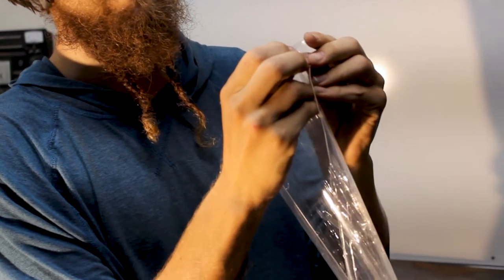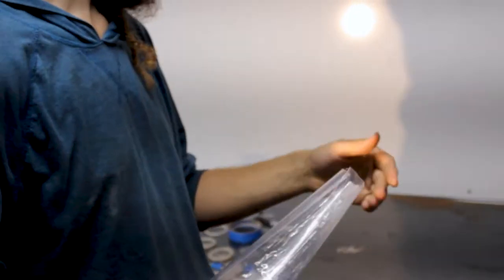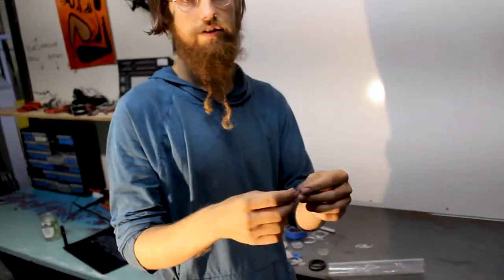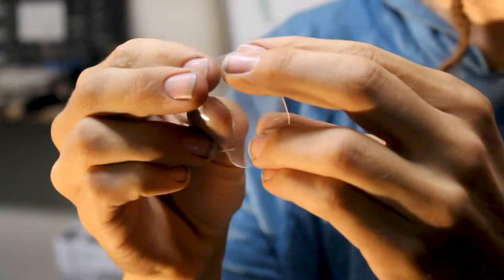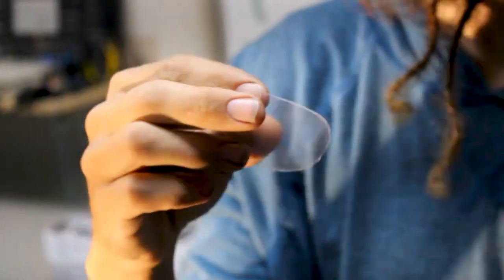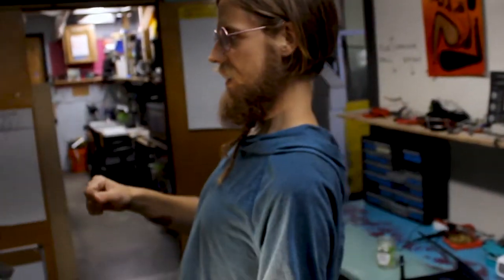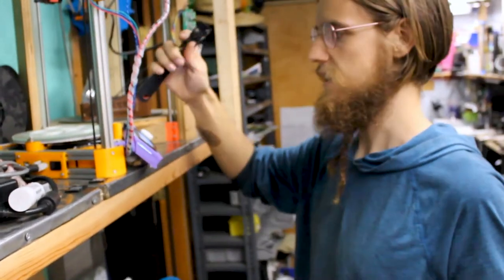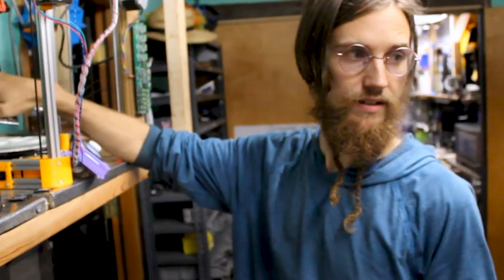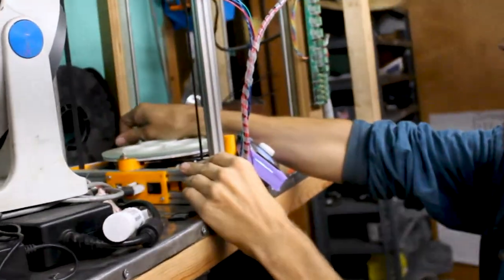it's got two protective coating layers, and then it's this fairly stretchy and somewhat durable, really clear silicone material. That's the part that flexes. I'm gonna scrape it off the 3D printer, the newest design. Take a look over here. So I just made my adjustments in CAD from that last one I made an hour or two ago. So I'm gonna walk you through making this one.